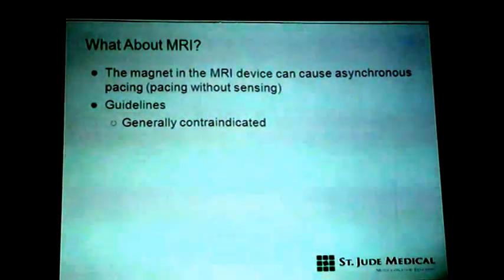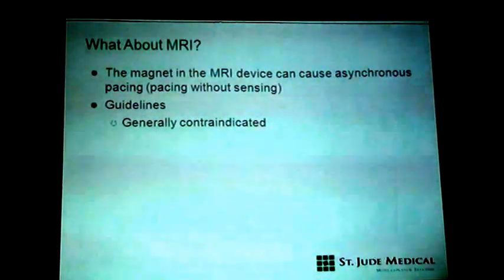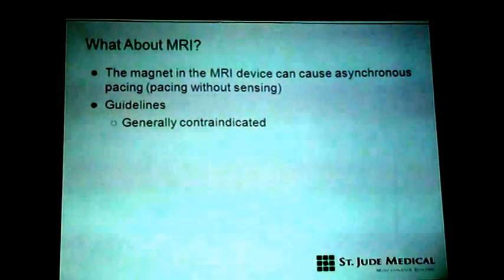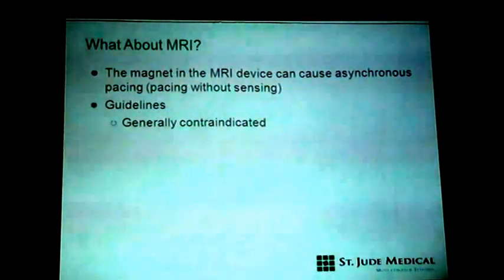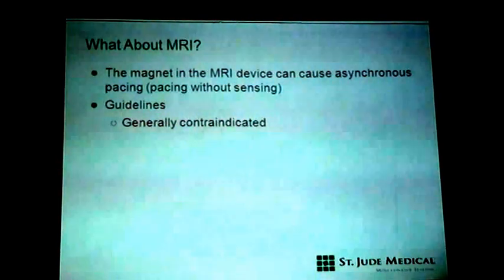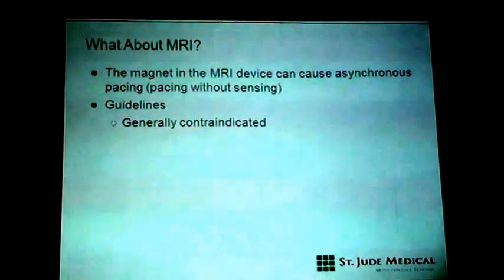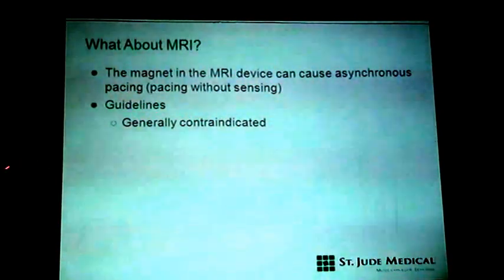But the cost is 4 times. Normally we get a general international brand pacemaker here for 42,000, while the market MRP is around 1,25,000. The cost of one MRI resistant pacemaker is 2.5 lakhs. But maybe in future, when it comes down to the 50,000s, it might replace the traditional pacemaker. So this is the option for you. Normally the guideline is that MRI should be contraindicated.